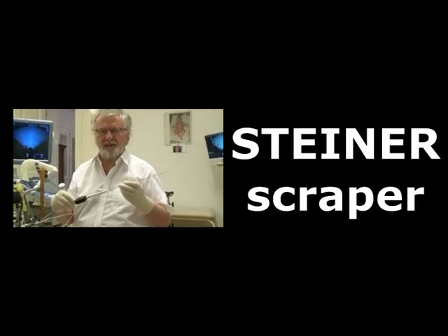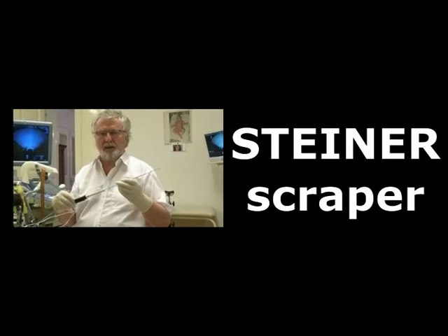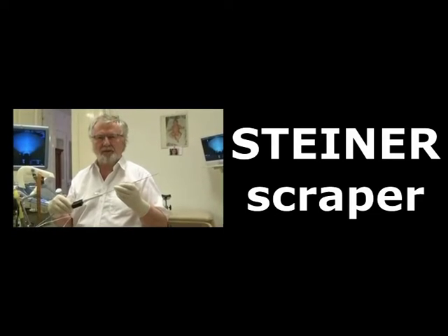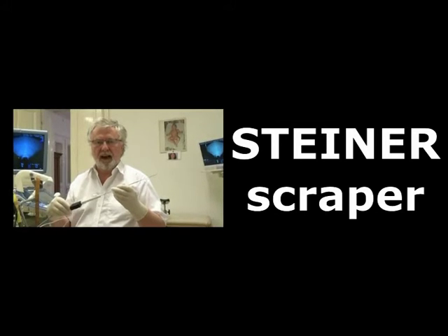Welcome to rwfetflex.com. I am happy to introduce you to my new Steiner Scraper. It is a device to enhance the release of the Cumulus Complex.